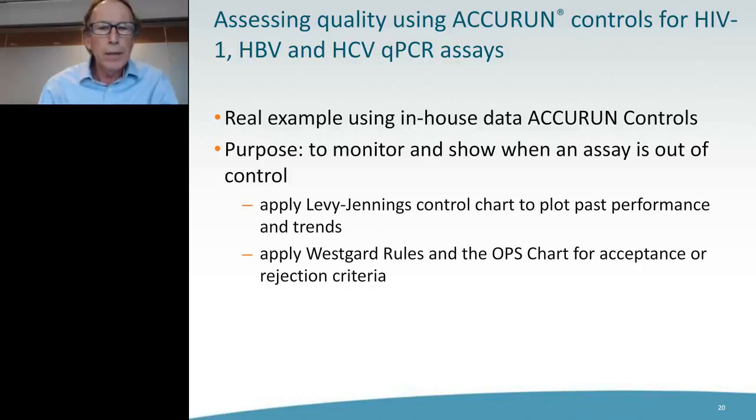And we'll apply the data to the Levey-Jennings control charts, which I'm sure you've all seen. It's a very nice visual on following trends over time. And then we're going to apply the Westgard rules and Westgard rules in the OPS charts. And you can easily access these formulas and these equations on the Westgard homepage, which is in our references.